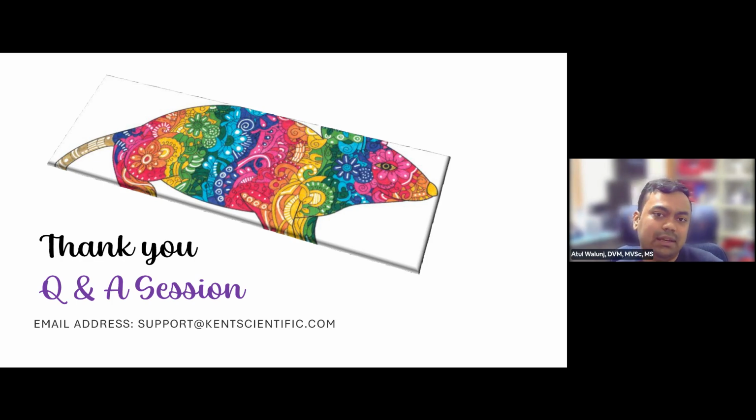So in a maintenance phase, or when the animal is on a nose cone, you can have the animal on the pad. That's what we would recommend. But many times the surgical procedures require surgical drapes, but that's also fine. Use surgical drapes that are as thin as possible to make sure the pads remain clean and aseptic. Having surgical drapes will not create any issue in animal warming because, as we mentioned earlier, there is no requirement for the animal to be in direct contact with the pad.